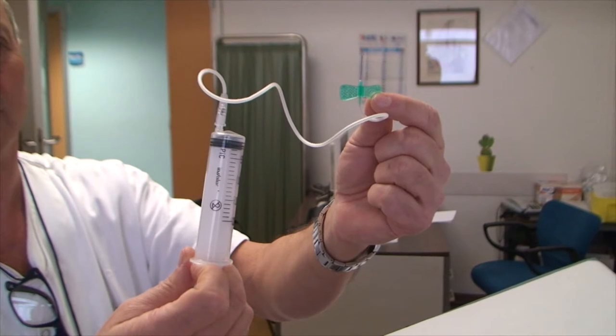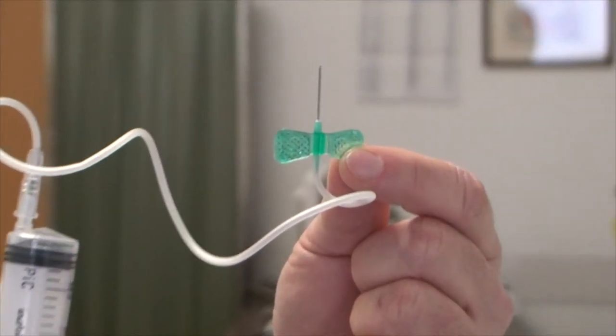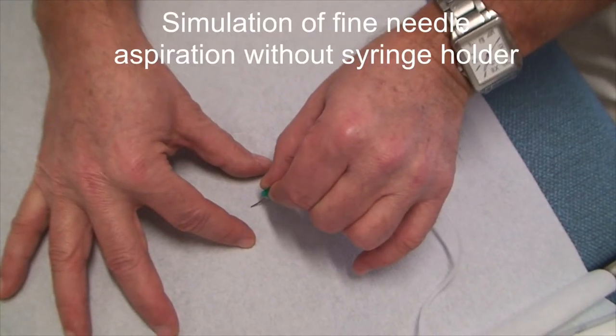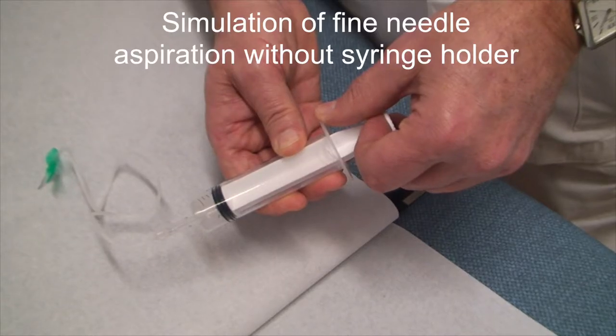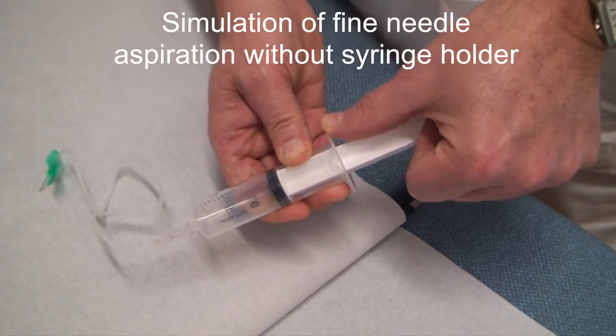Whenever the syringe holder is not available, the same maneuver requires a second operator. The first operator drives the needle, while the second pulls up the plunger at the beginning and releases the aspiration at the end.